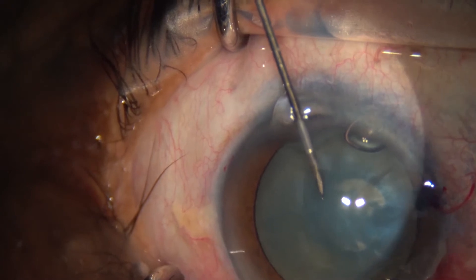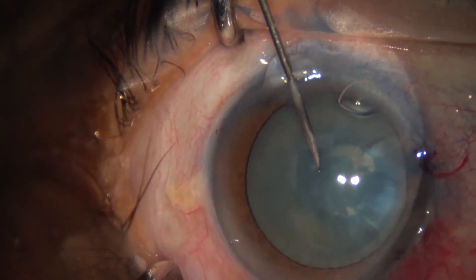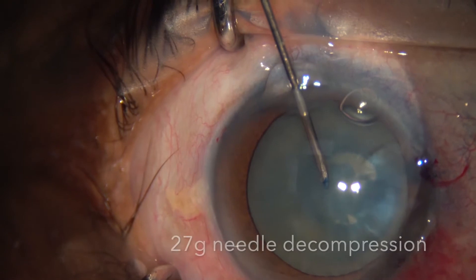Once the main wound has been created, we insert the 27-gauge needle to decompress the lens.